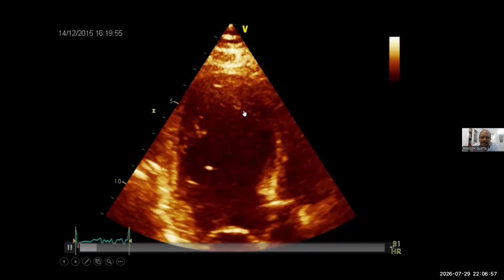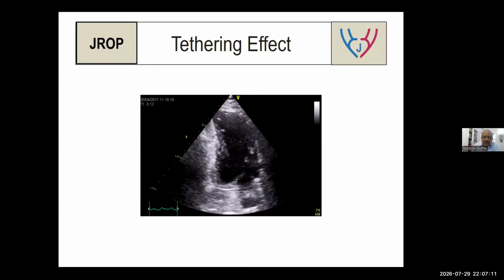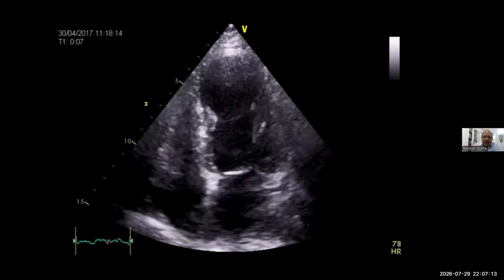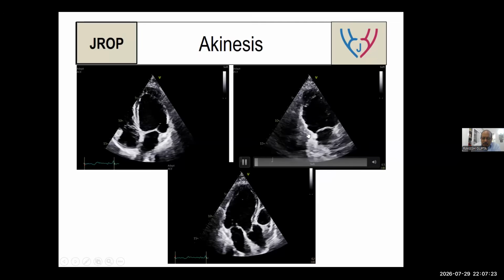What normally happens when we develop an infection, when we develop a wound? Initially, those wounds look swollen up and finally they become small, fibrotic. Fibrosis happens and scarring happens. Correct. So this is what a scarred picture is. Look, this is all a scarred picture. Now this is a classical example of a scarred picture. Look, this is the mid basal inferior wall. This is thinned out. If you measure, this segment is less than 6 millimeters in size and is hyperechoic.